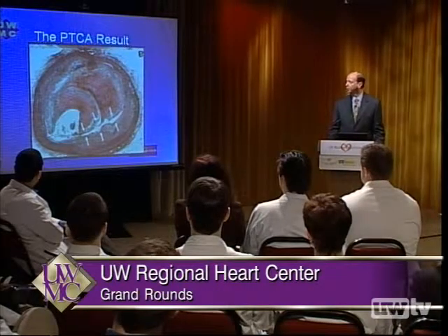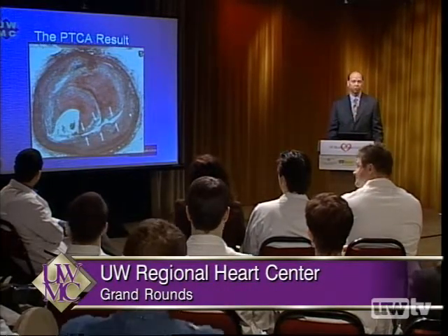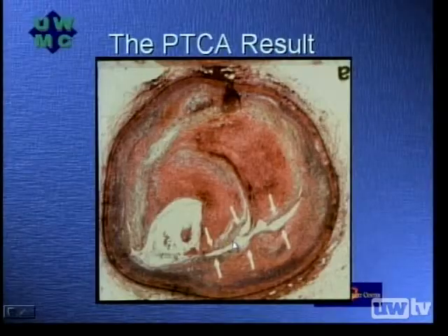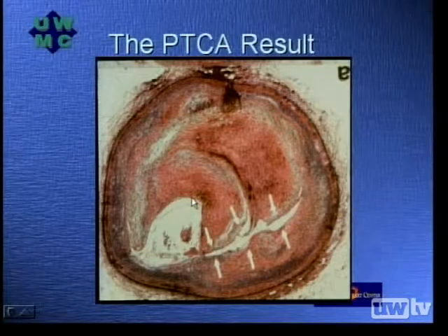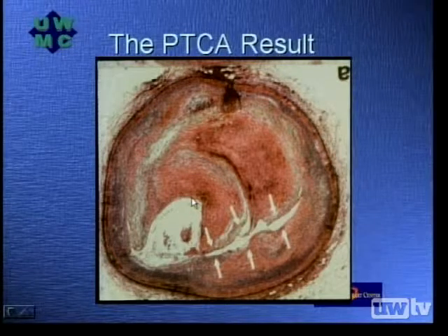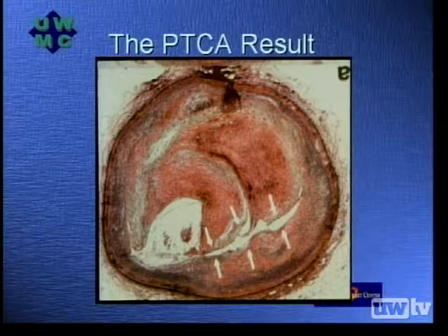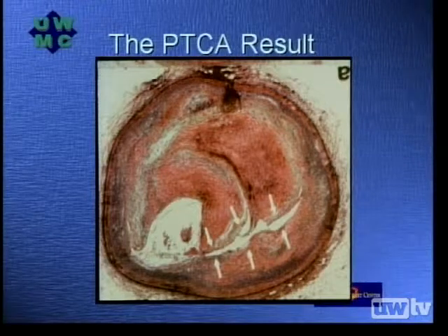Thank you, Dr. Clues. I have a similar slide. Most of my presentation will be of the clinical approach to the treatment of in-stent restenosis or even restenosis following routine angioplasty. This is a slide from the literature. The interesting parts of this slide are that this is the result that you have with standard balloon angioplasty, where you've had injury to the deep portions of the media and also injury obviously to the overlying endothelium, all of which bring about two particular problems. One is acute vessel closure, which we're not going to discuss today, and the second is the exposure of the subendothelial layer to those things that produce restenosis following balloon angioplasty.